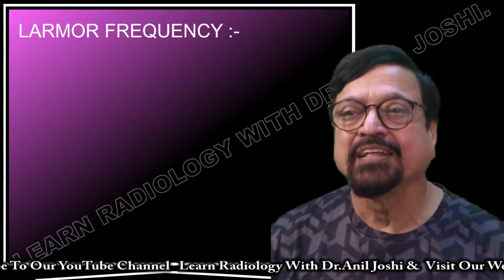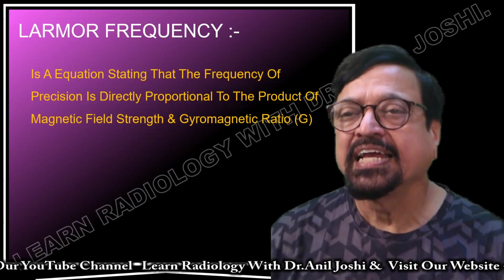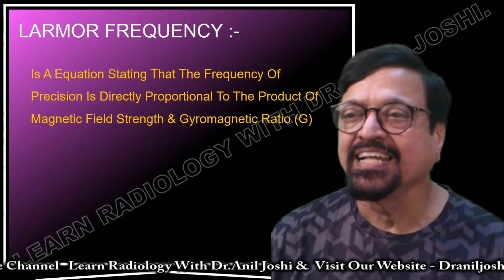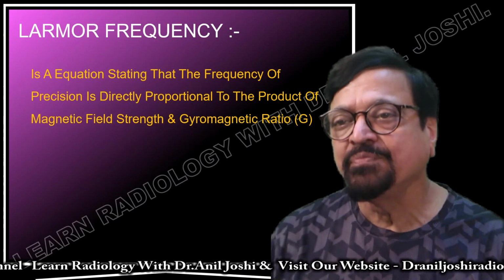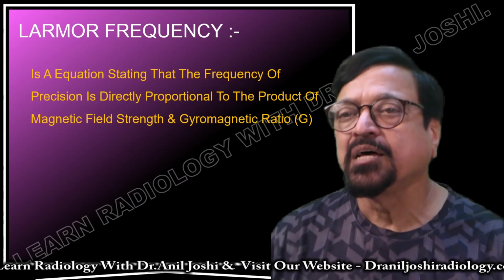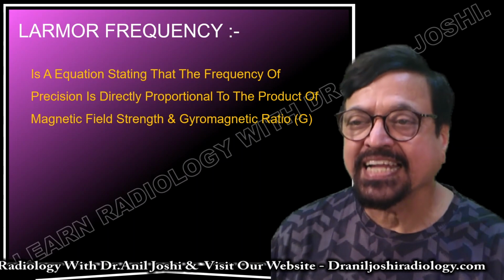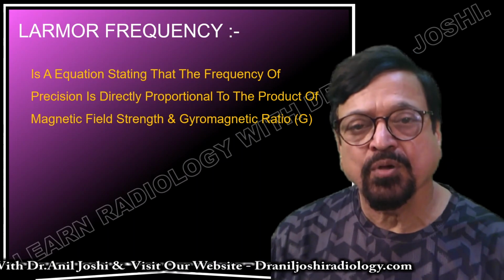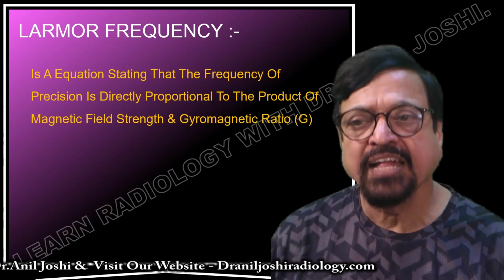Now going further, the Larmor frequency is the equation stating that the frequency of precession is directly proportional to the product of magnetic field strength and gyromagnetic ratio. So what are the two important factors in the Larmor frequency?